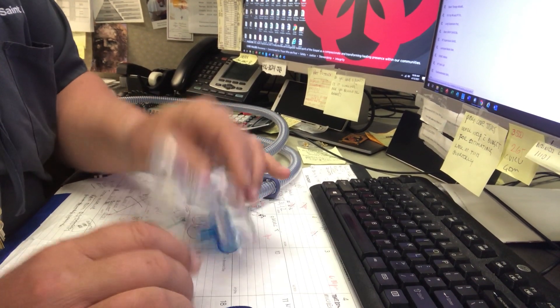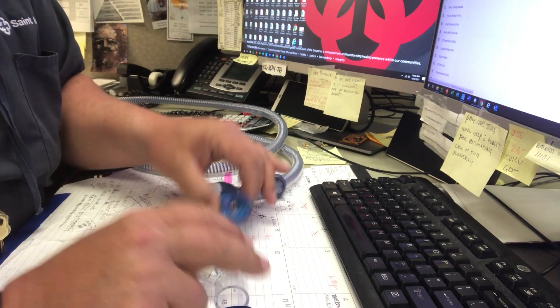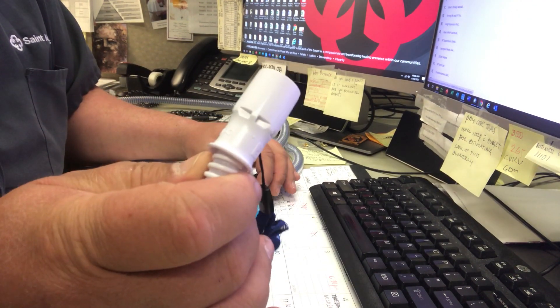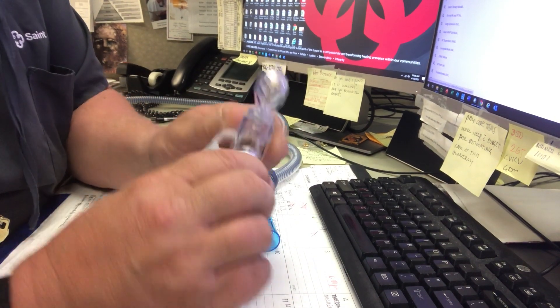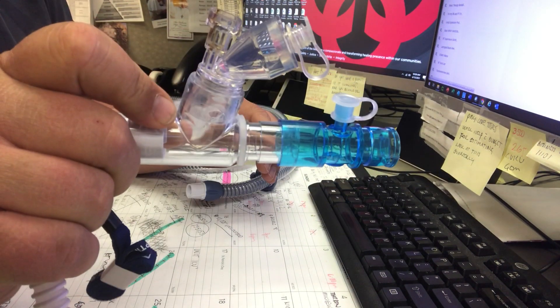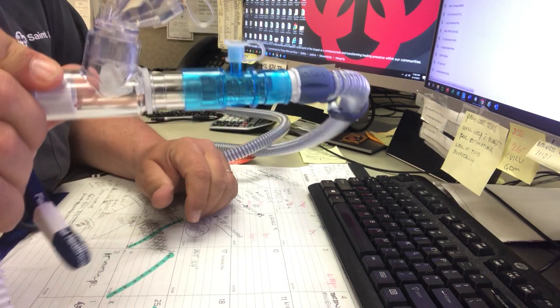You'll use your Aerogen parts as normal. You need one of these nice little U-adapters, Aerogen tubing, and Aerogen cannula. The cannula fits into the Aerogen tubing, to the U-adapter, to the high flow.